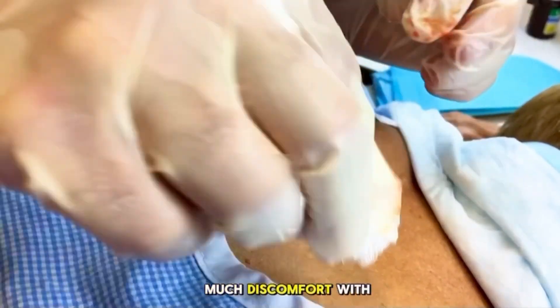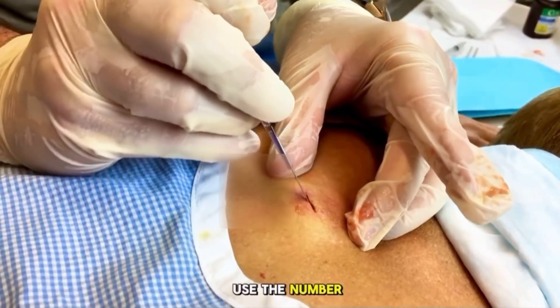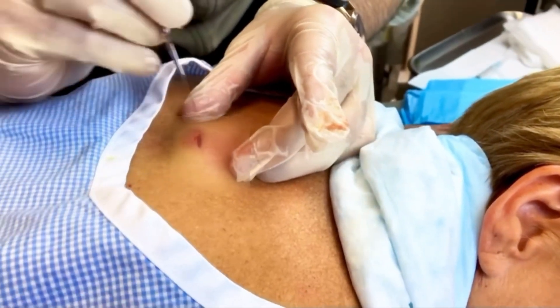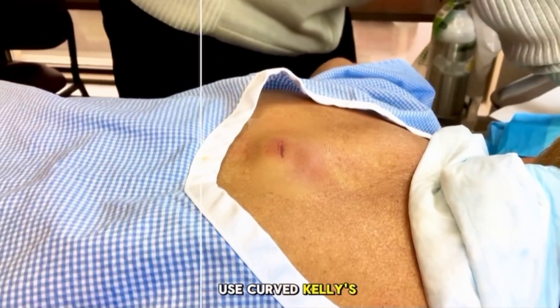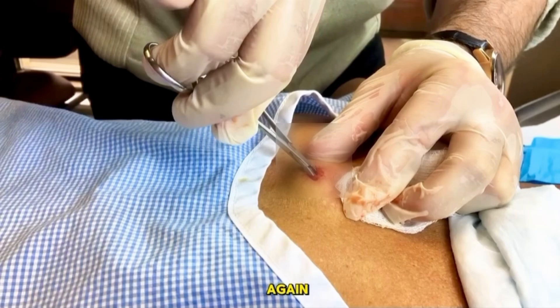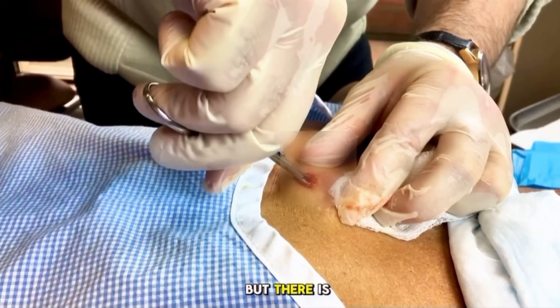Not having too much discomfort with that? Not too bad. So with this one, we talked about whether a cyst is loculated. I want to use the number 11 blade just to explore — I can feel that right there — you'll feel some pressure. And then I use curved Kelly's, which is this instrument here. I want to be gentle with it because the patient can't have perfect anesthesia with this. So you certainly want to break down some adhesions, but there is a balance.